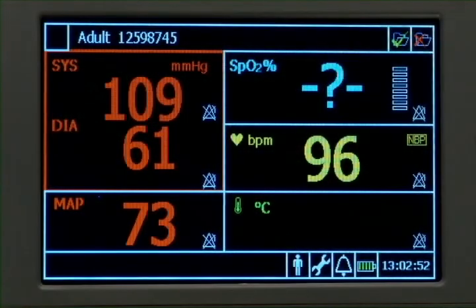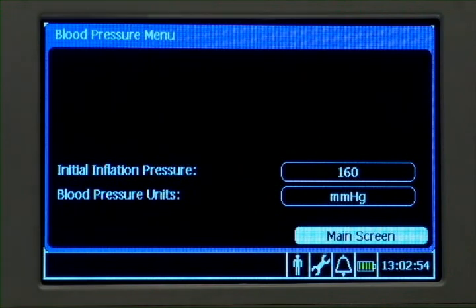Use the up-down key to highlight the NBP numeric pane and press select to bring up the blood pressure menu. Here you can make changes to the initial inflation pressure and the NBP measurement units.